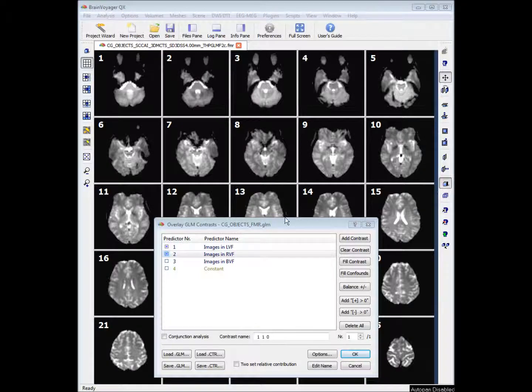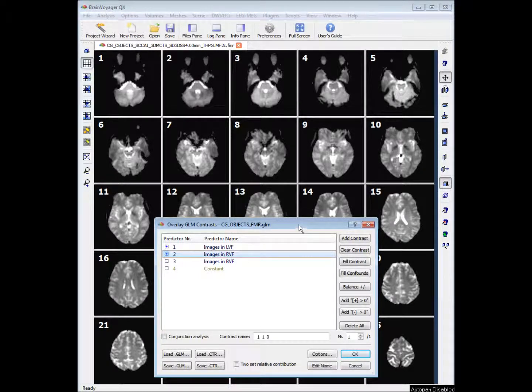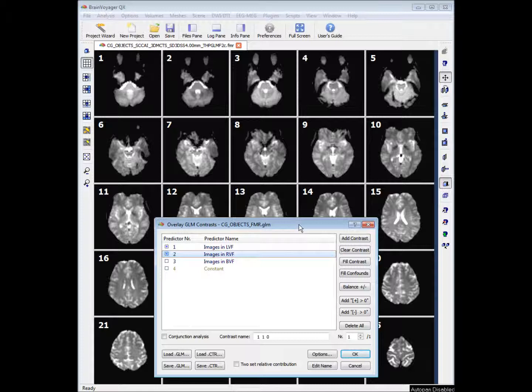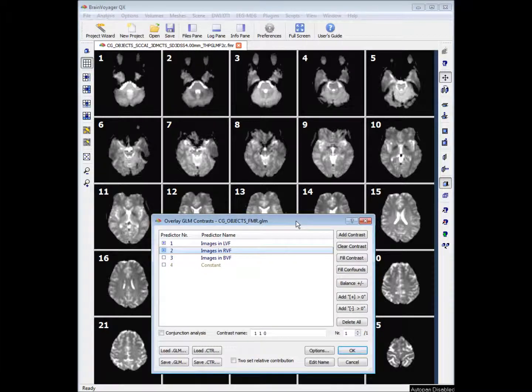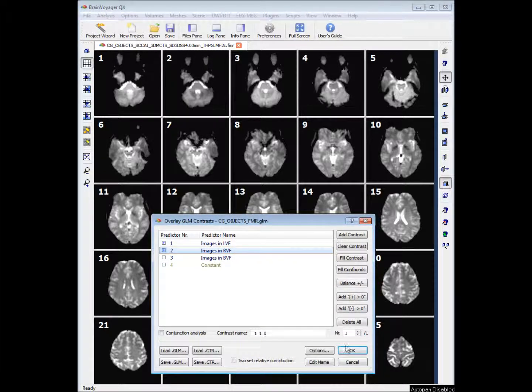In this tutorial we're going to look at detailed GLM analysis. In the previous step we created our general linear model and we're looking to overlay the GLM contrasts. We put a cross in the first two boxes and click OK.